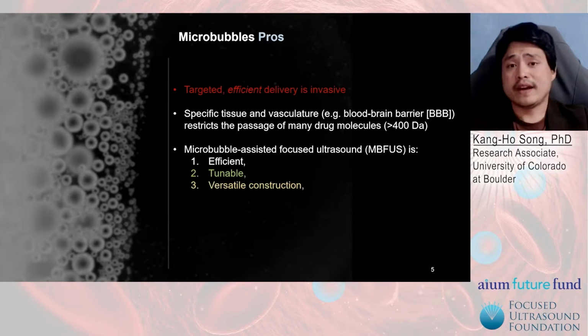The third pro is that, as you saw, there are many different types of microbubble constructions and many are yet to be explored, but they all have implications for pharmacokinetics, immunogenicity, or whether you'd like to attach a targeting moiety or conjugate a payload to your microbubbles.